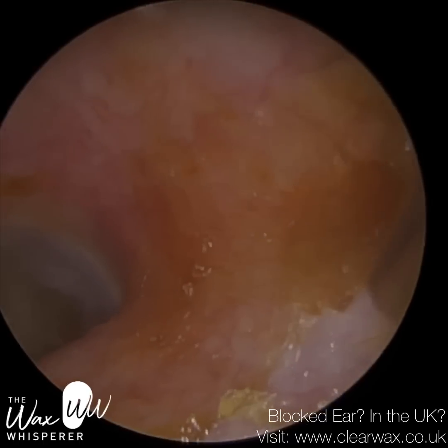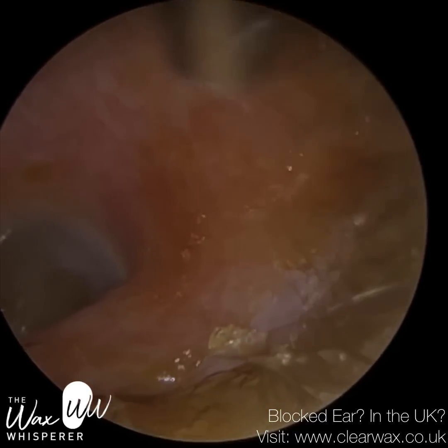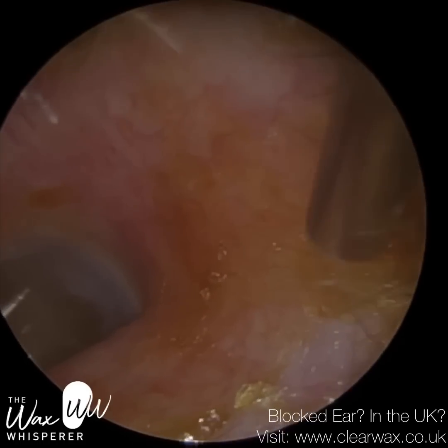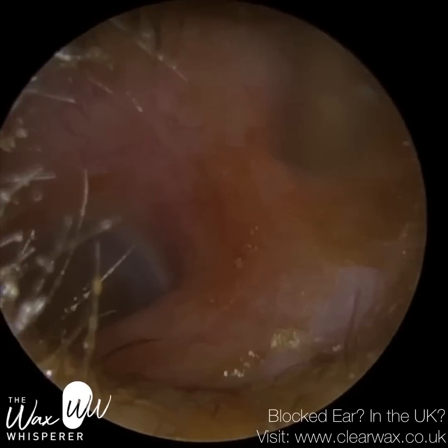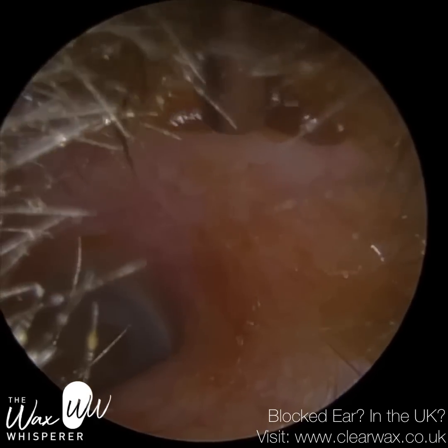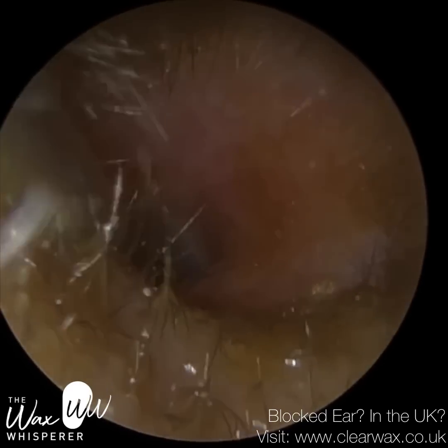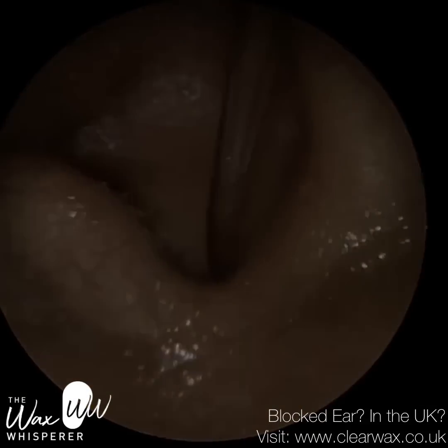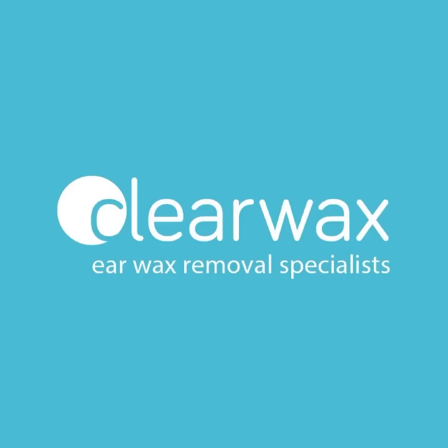Some patients of mine have to attend, believe it or not, every 3 or 4 months. They're quite extreme cases, but it does happen. On the other hand, you get some patients every 6 to 10 years. I would say the average is about 12 to 18 months if you are suffering from wax. You can, for whatever reason, it could be stress, diet, lifestyle, or for some unknown reason that we're oblivious to, go through phases where you develop more wax or less wax, so you might have to have it more frequently. So just say your average is 12 to 18 months, but it could be for whatever reason you need to have it done more frequently over a short period of time.